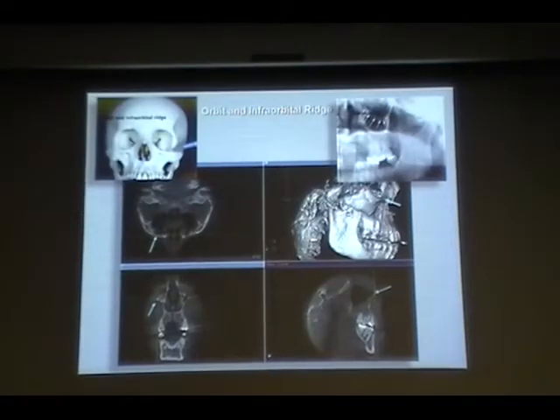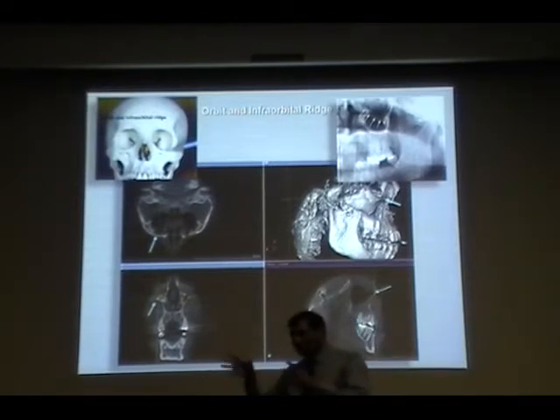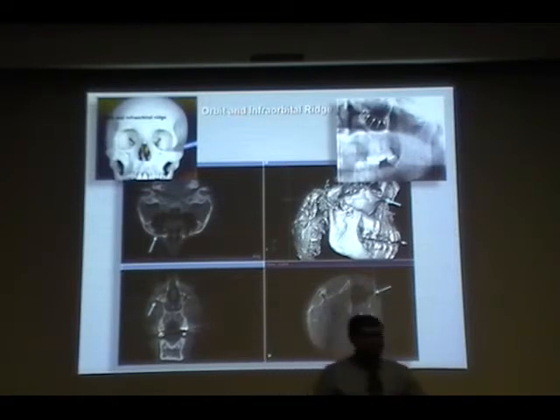The best way is to hold the skull in your hand, look at these images, and try to interpret. Looking at the image, it will sync very easily. So on the panoramic radiograph, you are going to see the infraorbital ridge or the infraorbital margin or the floor as a very thin white line. Again, here this is what you're going to see.